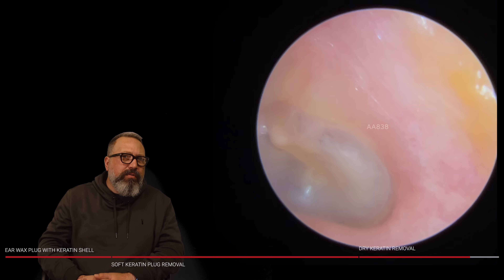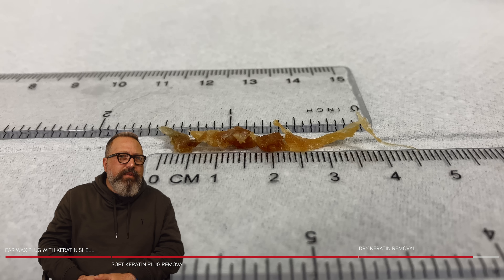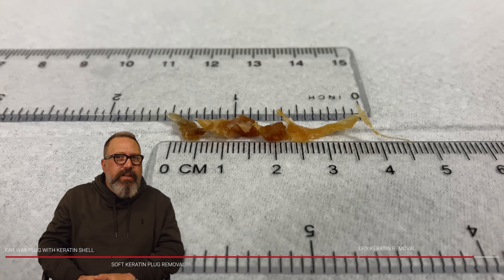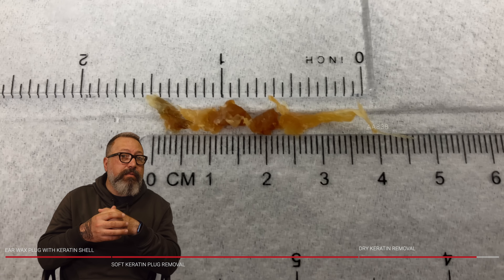What's going on beyond that? Nice looking eardrum there — it's all looking lovely and healthy. Four centimetres, inch and a half. You can really see some of those long pieces of keratin that came out there as well.